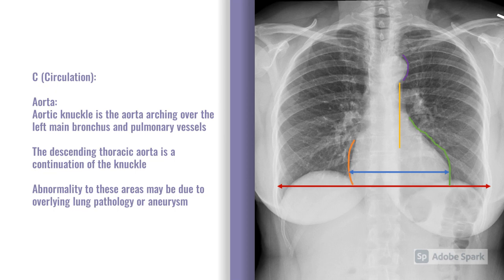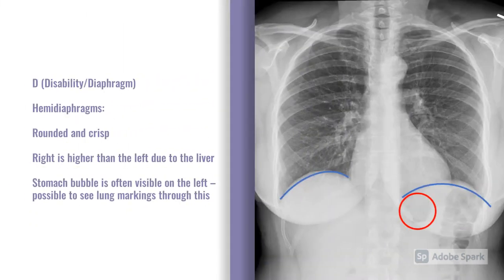Moving on to D — disability/diaphragm. We're looking at the hemi-diaphragms; they should be relatively smooth. The right is often a little higher than the left. Sometimes you get a hemi-diaphragm that's significantly raised, and that's important to comment on — but remember the right being slightly higher is within the spectrum of normal. When you're looking at the diaphragms, also have a quick look below, as you may well see a stomach bubble, which isn't of any clinical concern.